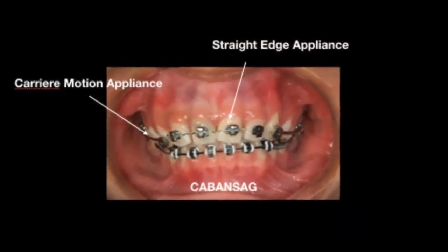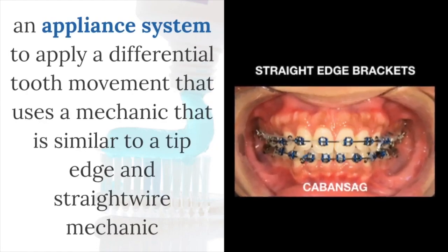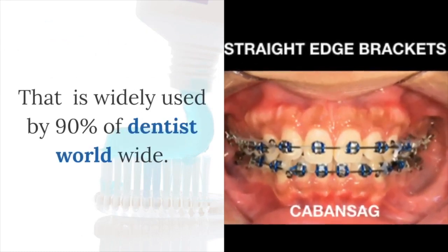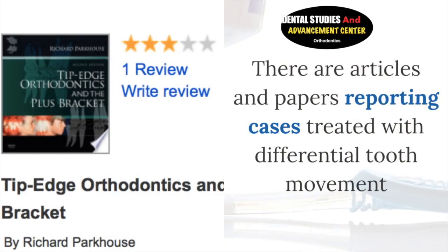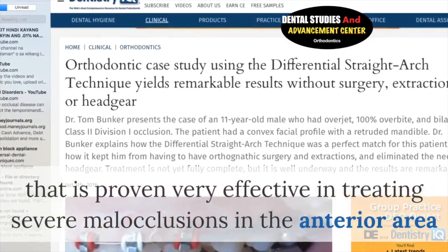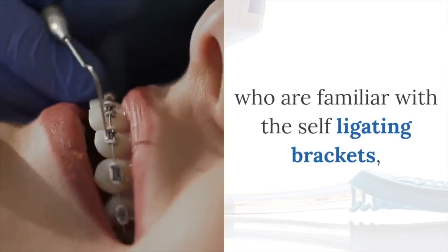The straight-edge, or simplified straight wire bracket, makes it possible for the clinician to apply a differential tooth movement that uses mechanics similar to the edgewise and straight wire mechanics widely used by 90% of dentists worldwide. There are articles and papers reporting cases treated with differential tooth movement, which has a rich history proven very effective in treating severe malocclusions in the anterior area since the 1960s.